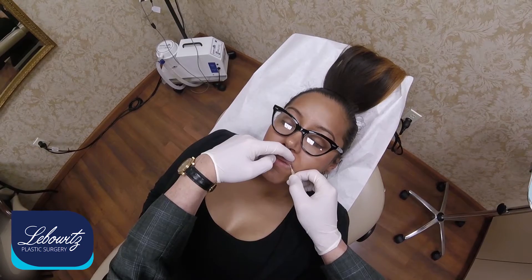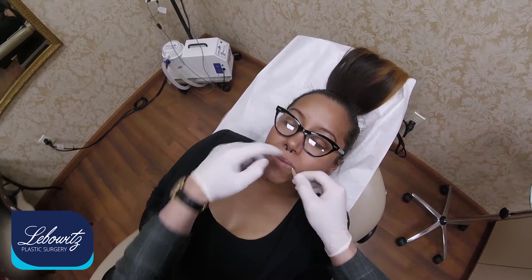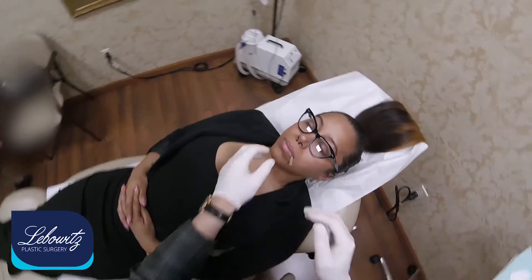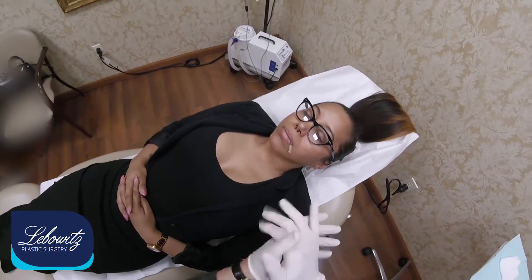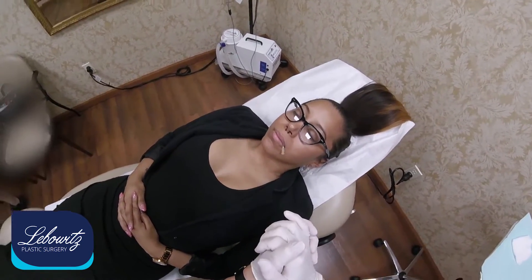So this is a regular needle — it's a pilot — and we're going to do uppers and lowers. We're going to put that little bit in, and that's a little pilot hole. We're going to let that stay for a couple of seconds to get that tracked and for hemostasis so it doesn't bleed. And I've already primed the blunt cannula.